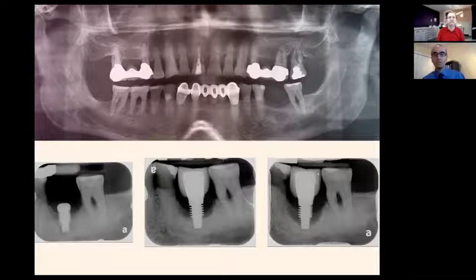Also, when we look at the initial diagnostic panoramic, we see a huge bone loss in the area of 3/7 in the furcation area, and the 4/6 furcation area. We see very significant bone loss on the mesial aspect of 2/7 with a very ragged surface on the distal, indicating that a tremendous amount of plaque and calculus has not been touched at all.